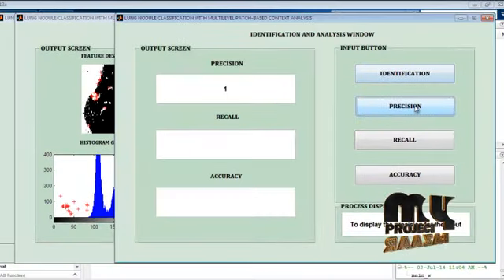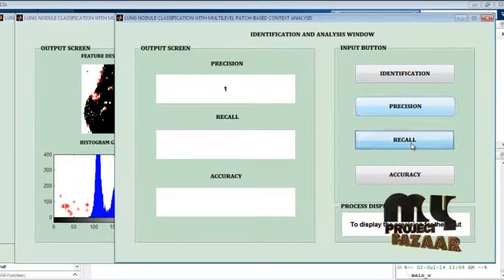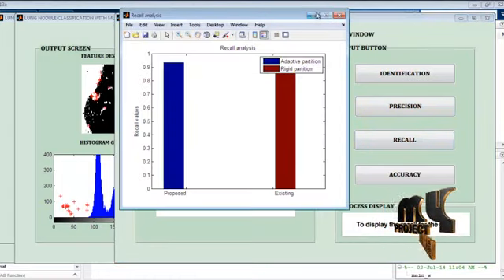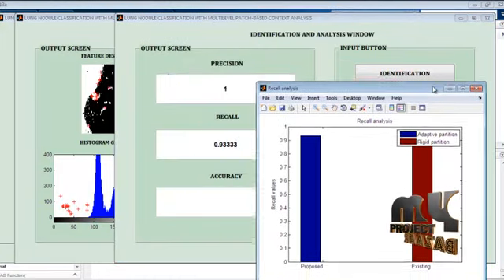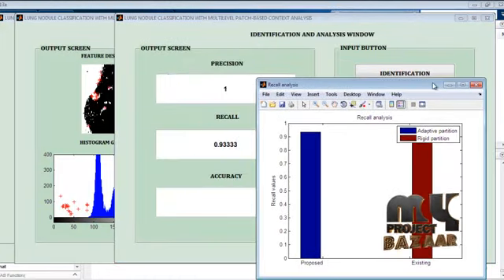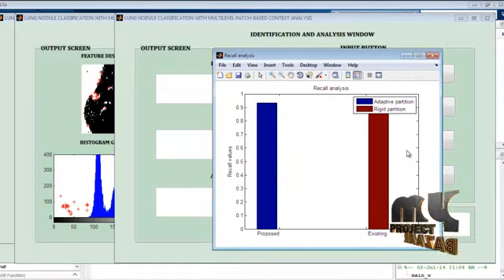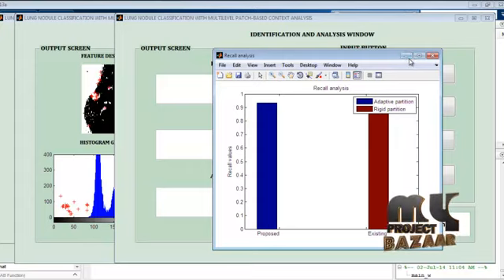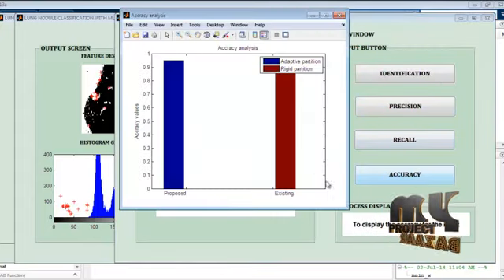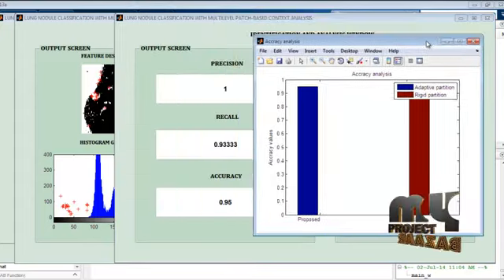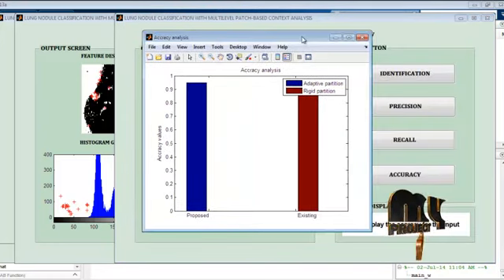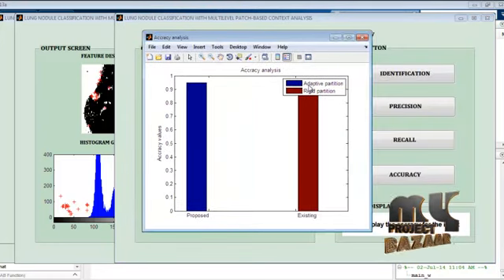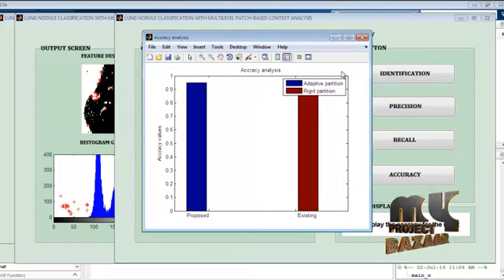Then the recall value is shown as 0.9933, and the graph comparing adaptive and rigid partitioning is displayed. Then the accuracy value is shown as 95% for this method, and the adaptive partition versus rigid partition accuracy graph is displayed.